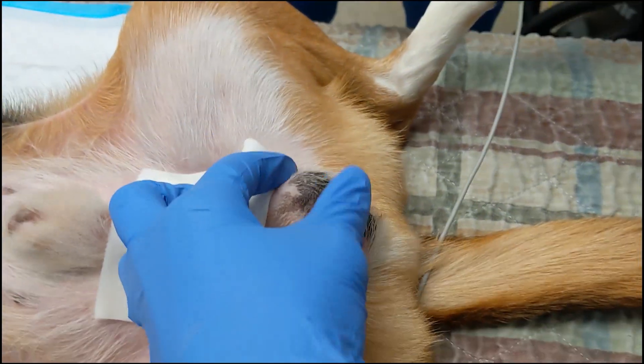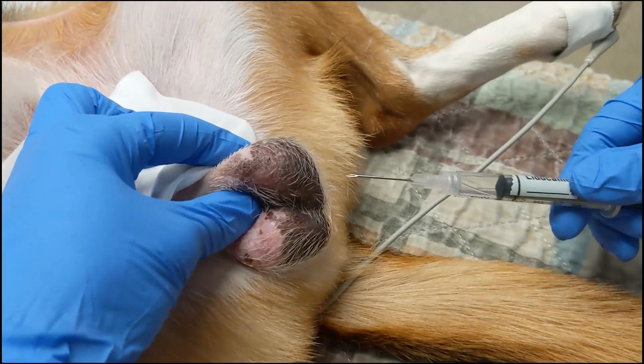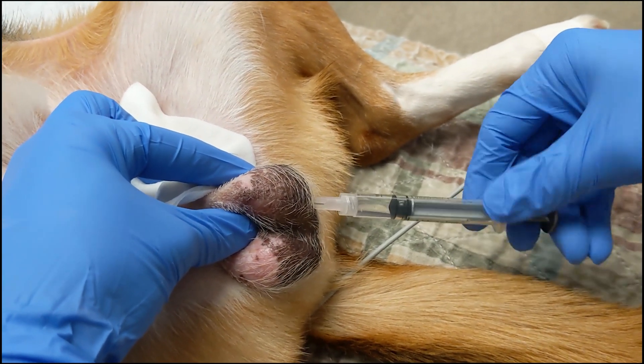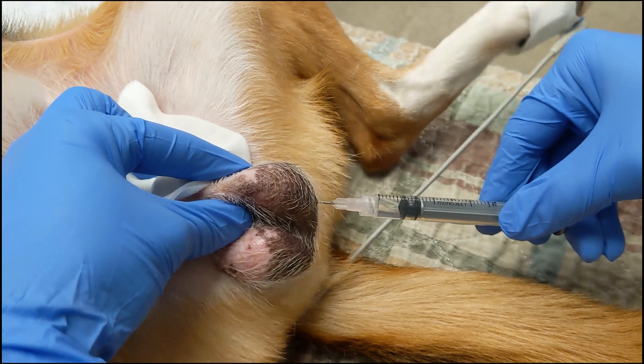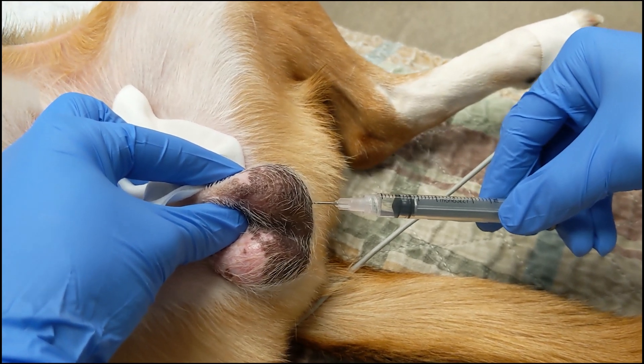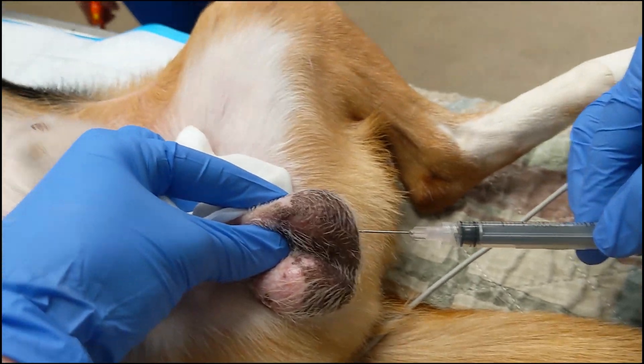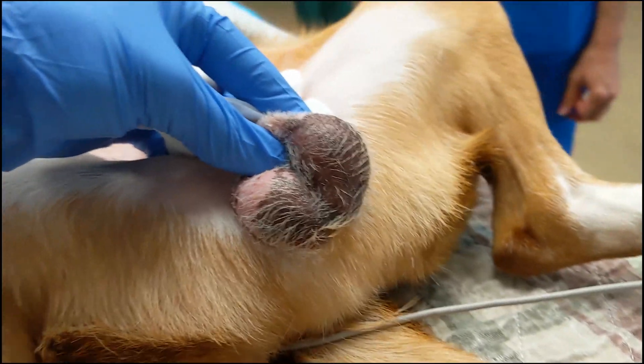In this patient, a lidocaine testicular block is performed for multimodal local anesthesia. The syringe is always aspirated prior to injection to prevent accidental IV administration of local anesthetics. The structures in the spermatic cord are desensitized, and this minimizes the response to surgical manipulation.